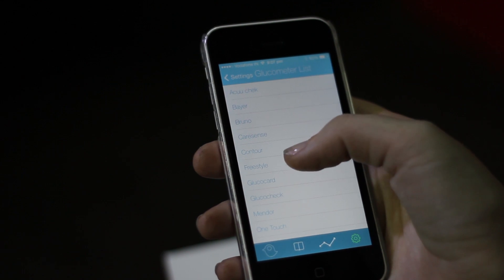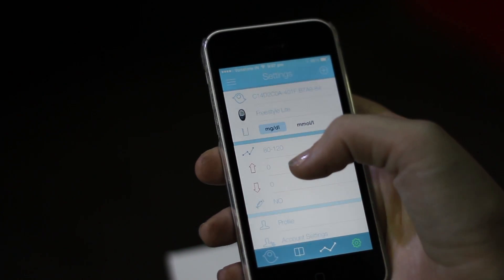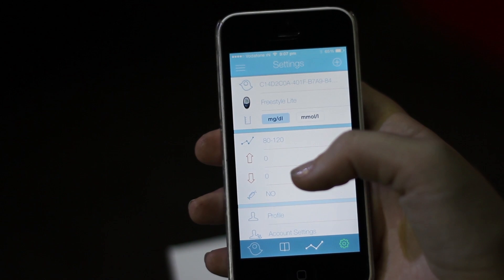Then you're going to put in your meter — mine is the Freestyle Lite — and then we're going to update what units you use.